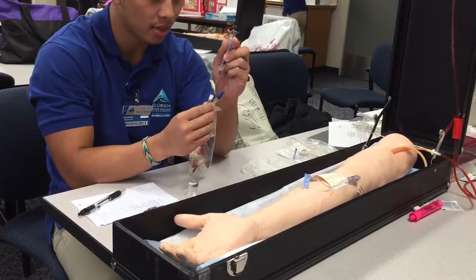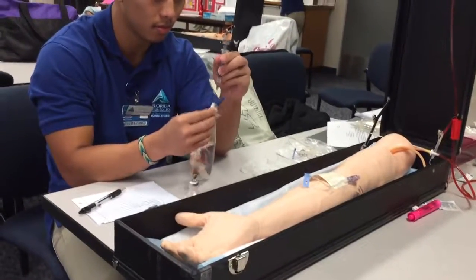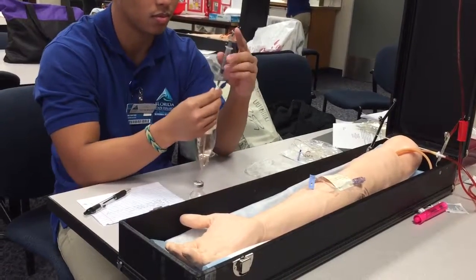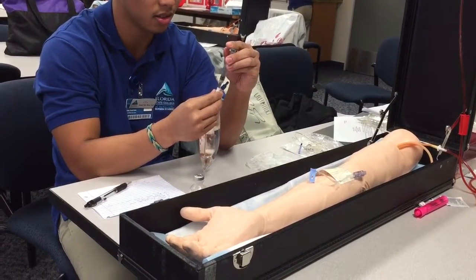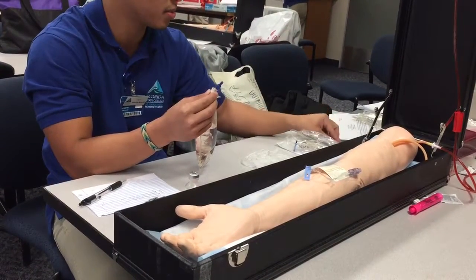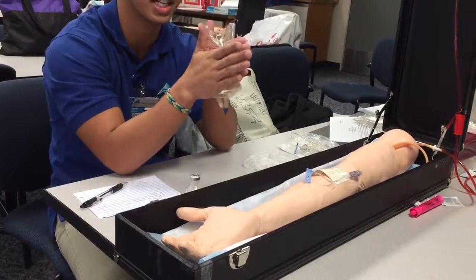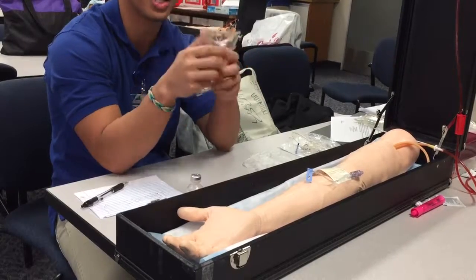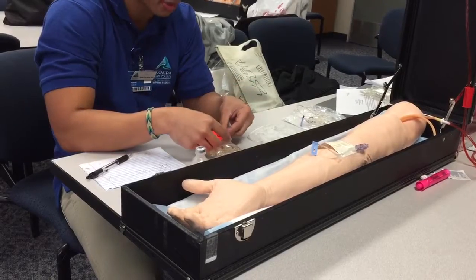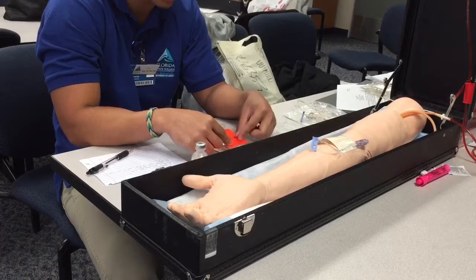It's a cup. And I'm going to inject the medication into the mini bag. This is 0.5 milliliters. Go ahead and take this off. I'm going to dispose of that into the sharps. I'm going to mix this a little bit, just to make sure that the medication is diluted in there. So next I'm going to have to put the medication label on. You're going to put the dose, the route, the drug name, the time. You're going to put your initials, patient, and the room number.